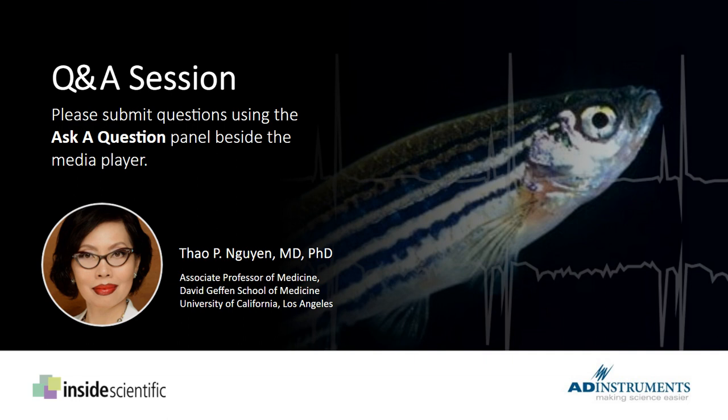You see, because the trick is, in in vivo ECG recording, you can't really see the heart to know how to position it best, right? You have a rough idea of how it is.